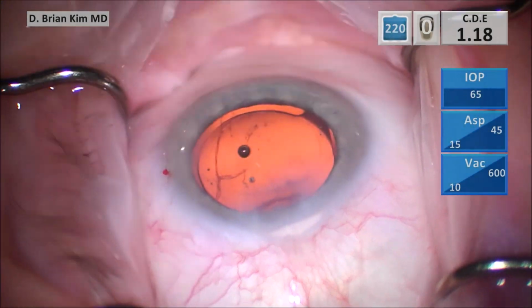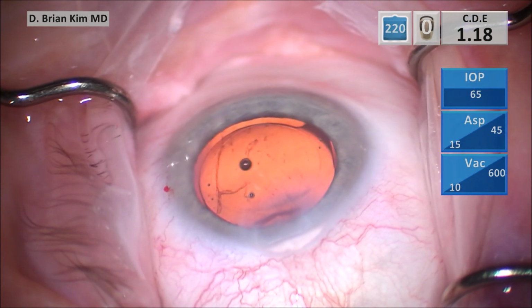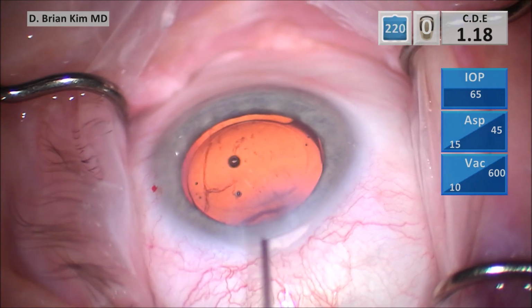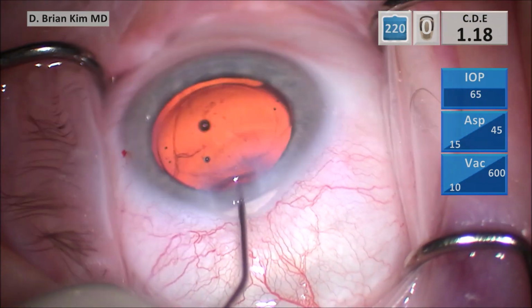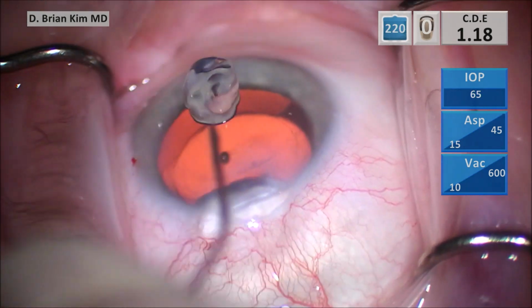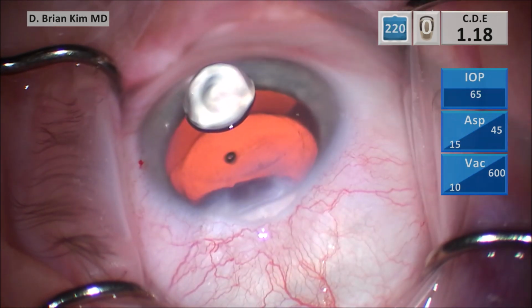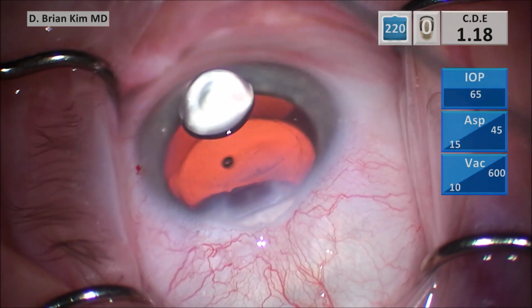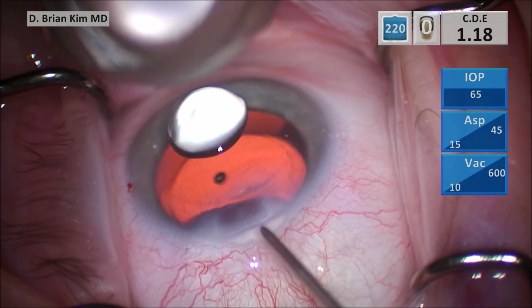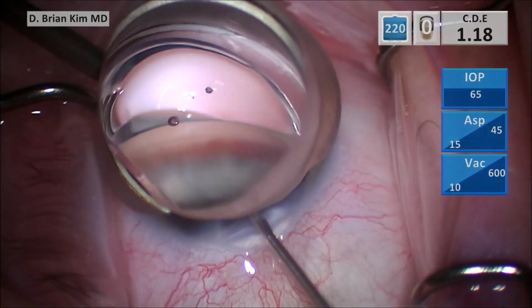And so this is the patient's eye here. You can see the cataract surgery has been performed. The eye has been rotated away from me. I'm injecting some more cohesive viscoelastic to fill the anterior chamber and open up the angle. I put a dollop on the surface as well. My technician put a dollop on the gonio lens as well. So this is the iStent Inject sleeve. I'm going to place the device into the eye first, and then I'm placing the gonio lens on top.